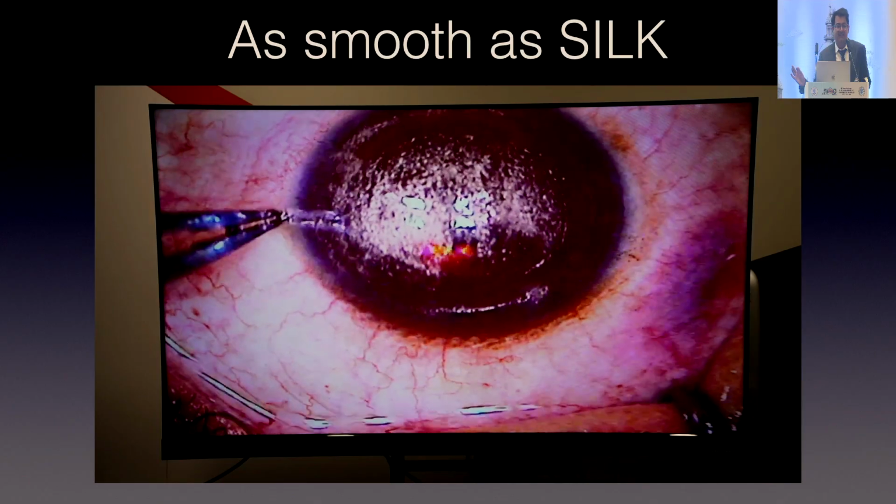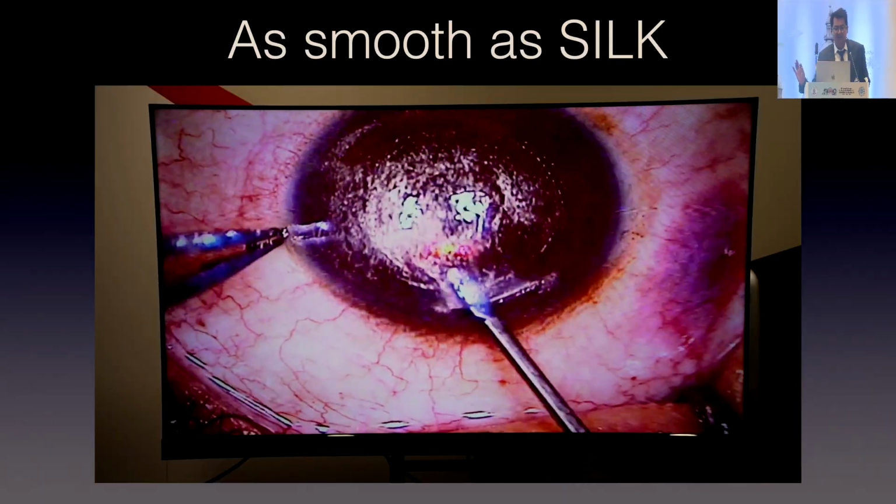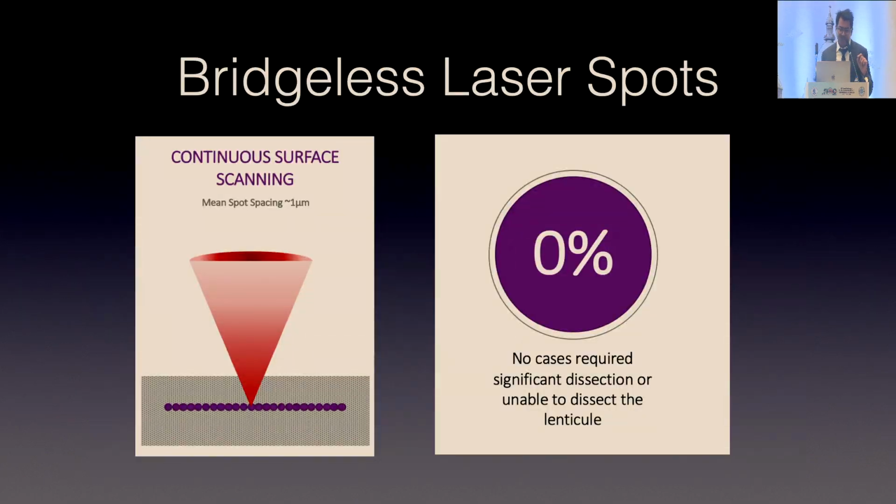And now I'm going below the plane. It just comes out like wow. This is the beauty of SILK. It is virtually dissectionless.